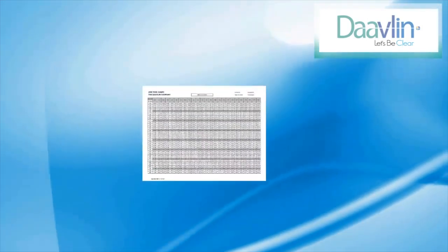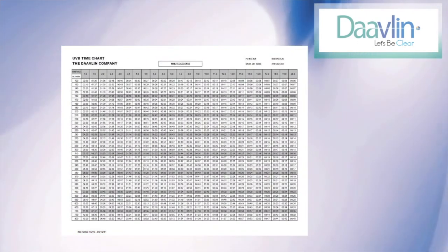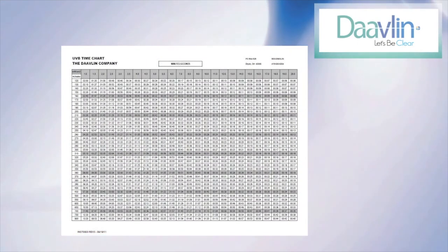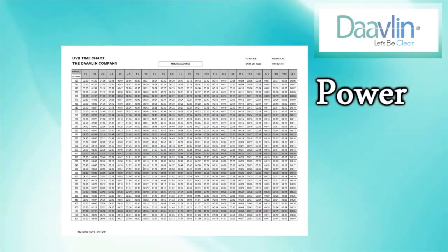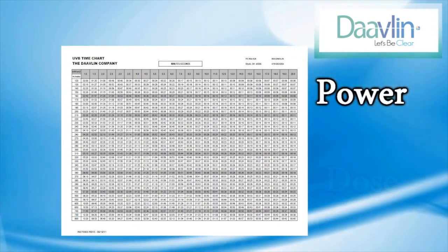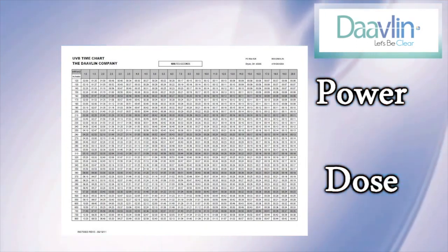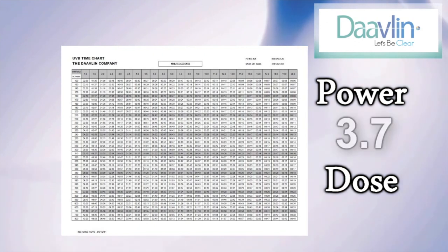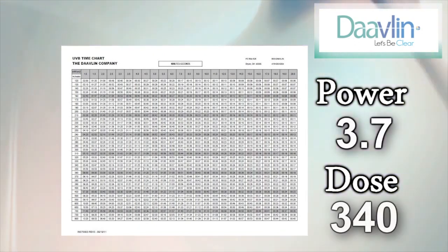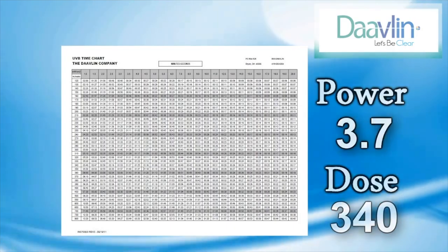Next, we will use the UVB time chart to calculate the proper treatment time. You need to know two numbers here: the power of your unit, which we determined in the last step, and the dose prescribed to you by your doctor. In this example, let's assume the power output is 3.7 and that our doctor has prescribed 340 millijoules of treatment.